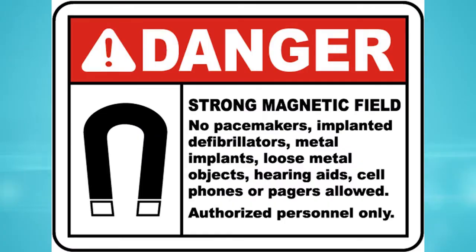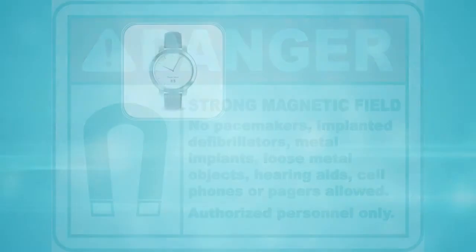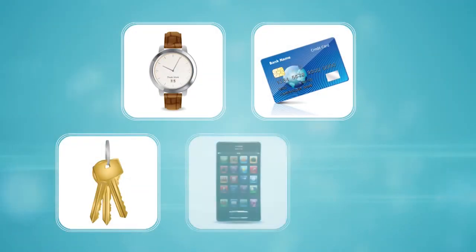Due to this, patients must not enter a room with any items made of ferromagnetic metals or objects which can be demagnetized. These include watches and magnetic cards.